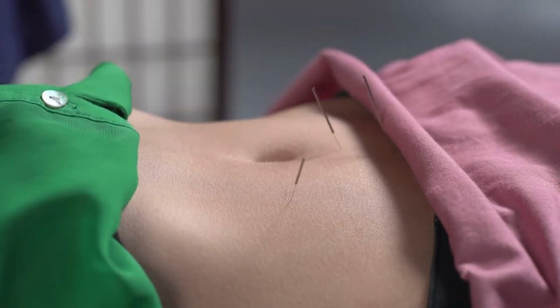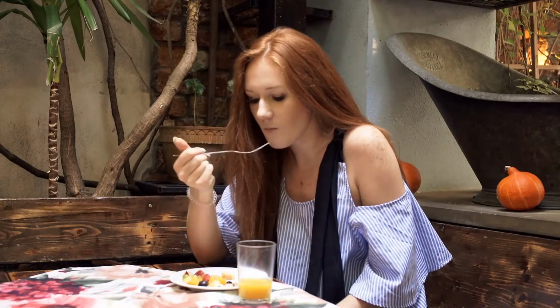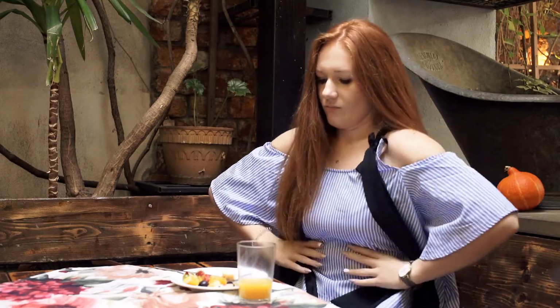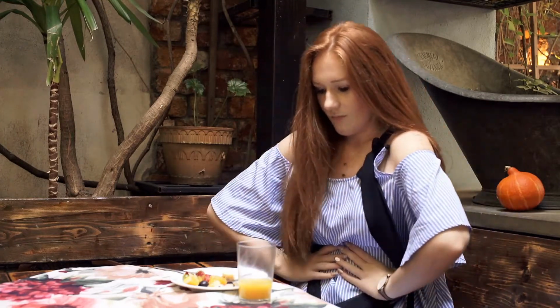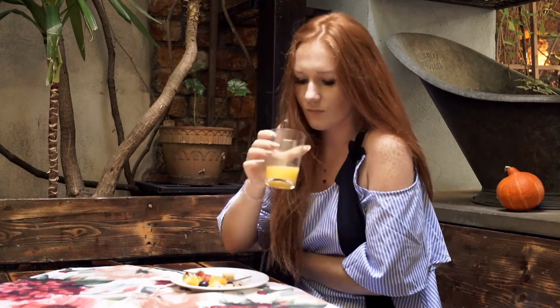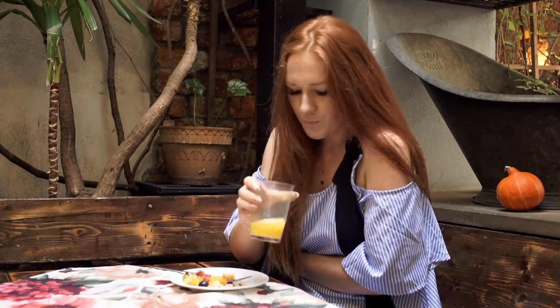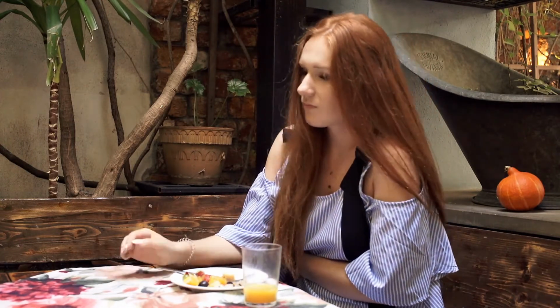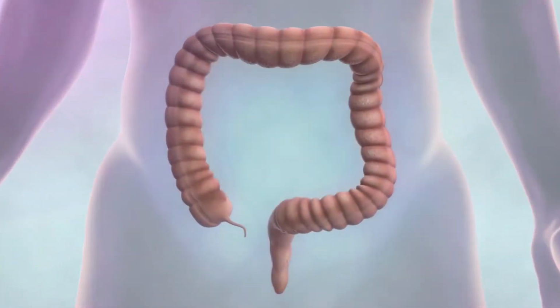What are the different types of endoscopy tests? During an endoscopy test, a thin tube with a camera attached to it is inserted into a person's body. The different types of endoscopy tests earn their name based on what part of the body is being examined. For example, a bronchoscopy is used to examine the lungs, while a laparoscopy is a test done to examine the pelvic area. Other endoscopy tests may be performed to look at the digestive system, reproductive system, or the joints.